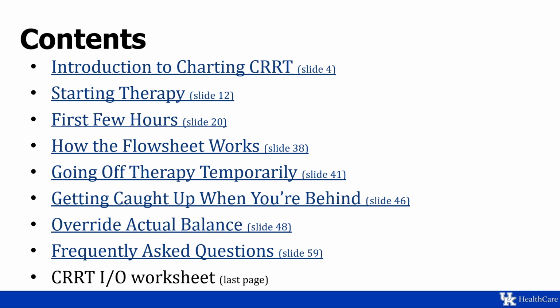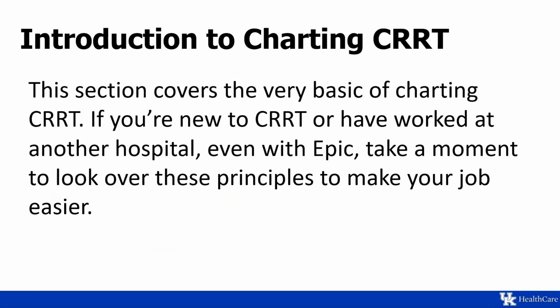This presentation will cover a variety of topics, including a brief introduction to charting on CRRT, starting therapy and charting the first few hours on various ultrafiltration goals. We'll have a little section on how the flow sheet actually works for you nerds out there. We'll talk about how to chart when you've gone off therapy temporarily and getting caught up when you're behind, overriding the actual balance, which is very useful knowledge to have, and some frequently asked questions. So we will start with a brief introduction to charting on CRRT.